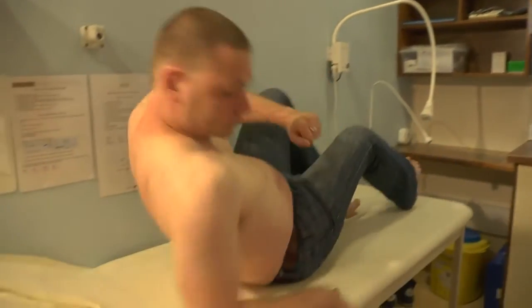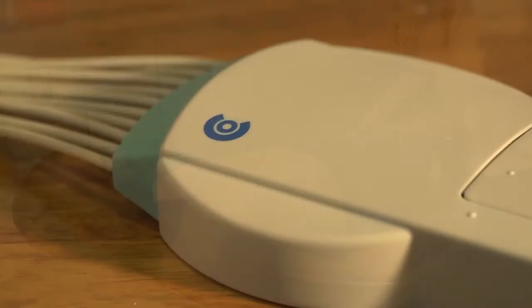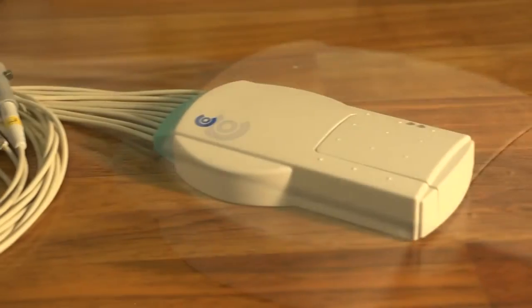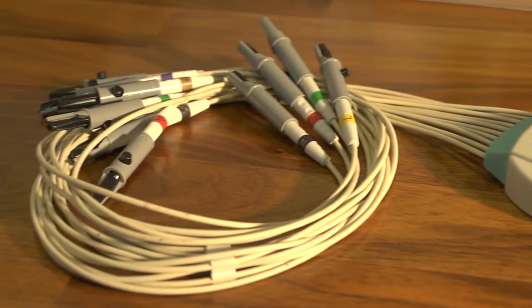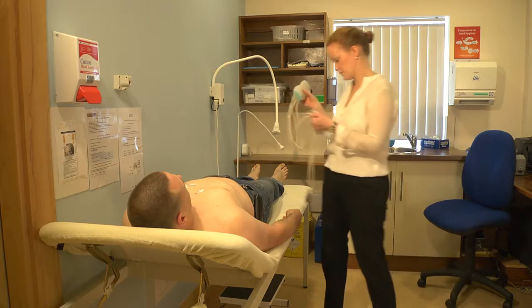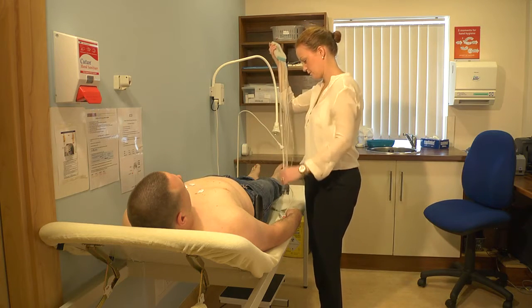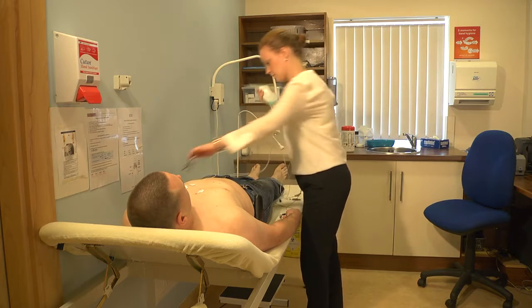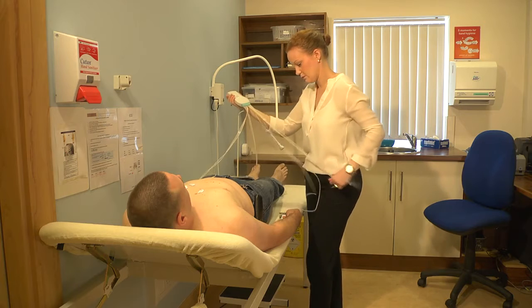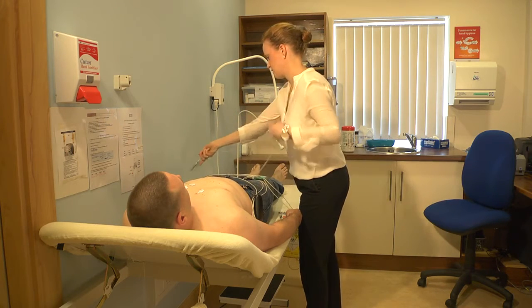Here we are in our surgery. The nurse is going to take an ECG using the Cousteau Cardio Bluetooth ECG — this is an extremely easy device to use in your surgery. Yvonne, our nurse, is going to attach the leads to this patient first. As you can see, she can separate out the leads very easily, which is often a problem because they get tangled up, and she's now going to attach the leads to the patient.